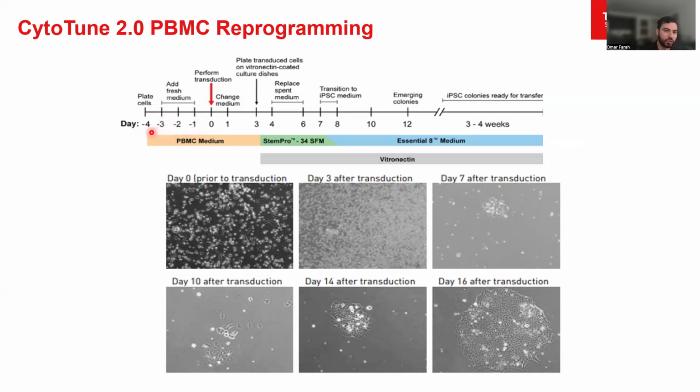So we culture our PBMCs, which we tend to culture in suspension, right? With a PBMC specific media that is usually supplemented by growth factors like SCF, GM-CSF, and IL-3 as well. And one thing I will note here is we have seen, and there has been some data in the literature to indicate that this expansion period or culture period prior to transduction for PBMC specifically, the longer it is, the slightly better the reprogramming efficiencies tend to be as well.